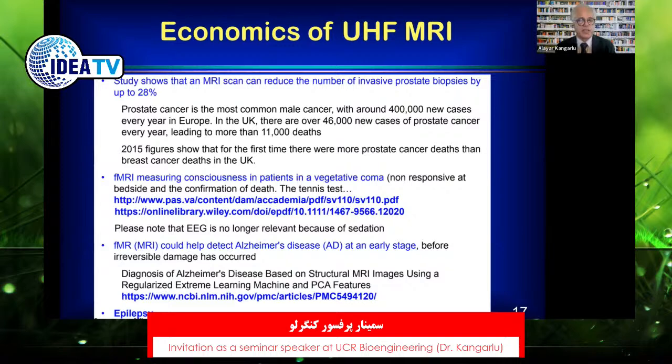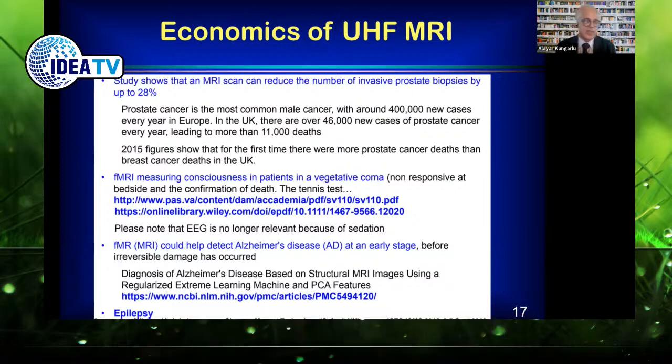The economics of ultra high field MRI is actually maybe in the mind of people who have to pay these millions for MRI scans, especially ultra high field MRI scans. The market price for these ultra high field scans is about $1 million per Tesla. So a 7 Tesla will cost roughly anywhere from $5 million to $10 million, depending on how good of a negotiator you are.